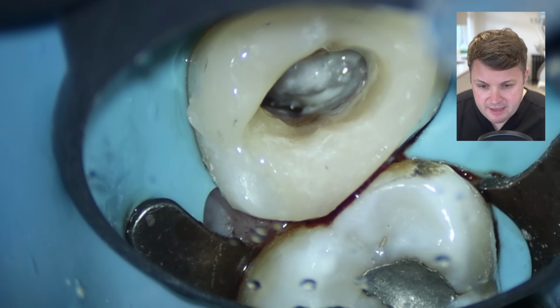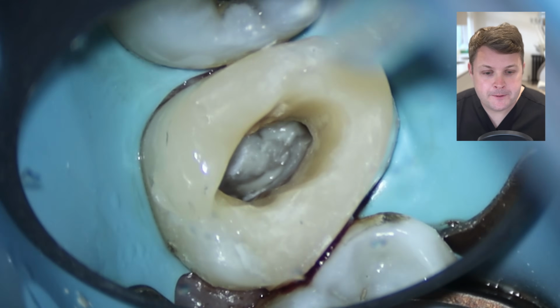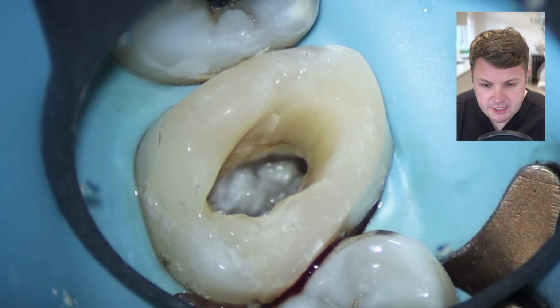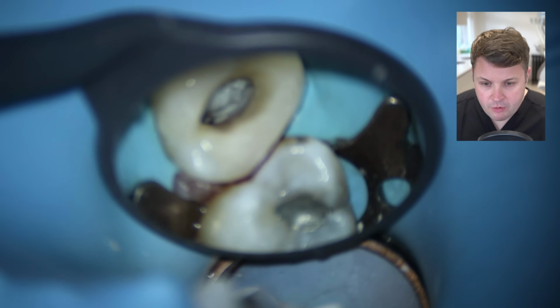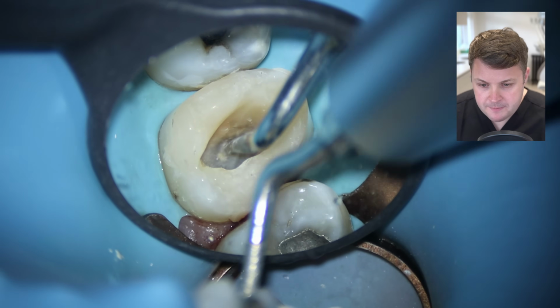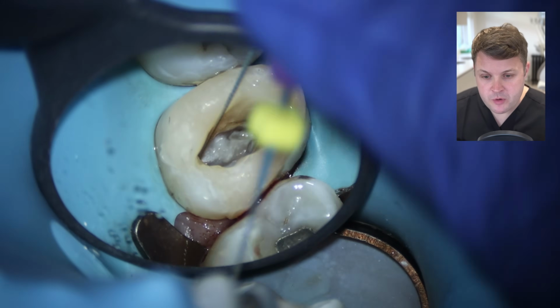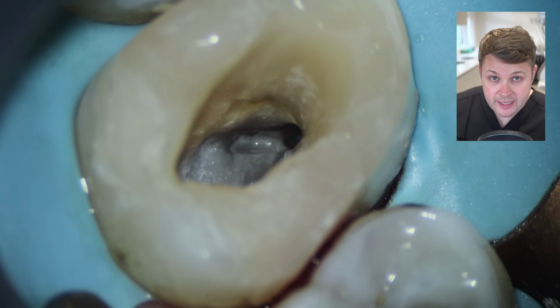So if I sort of negotiate any further down there, I think that's going to be perforation town. So we can see here that the MB2 orifice is pretty obvious. And again, what I want to do is remove that palatal shelf, get a bit more straight line access for this MB2, because it is quite closed up.